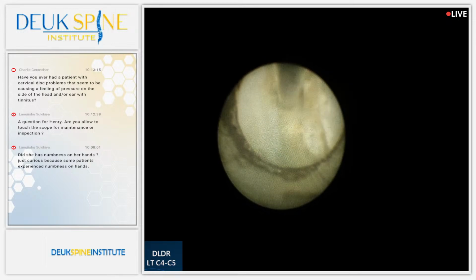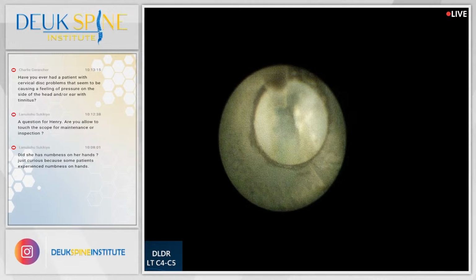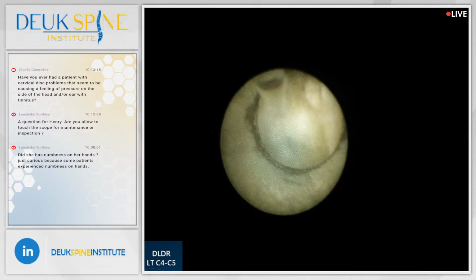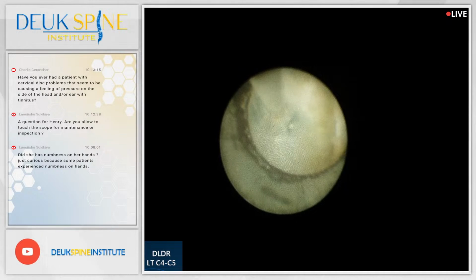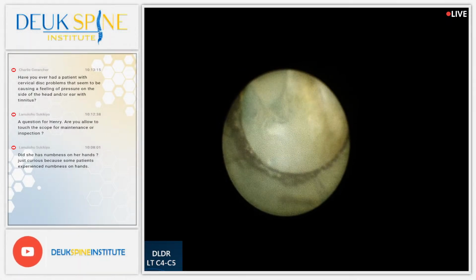Why? Because the laser is so precise, and you can actually see what you're doing. All right, Luis, let's see what we got here. I know there's a big herniation right here. You can kind of see it right there, where it tore through. You guys see the tear? The blue tear? Yes, we do.